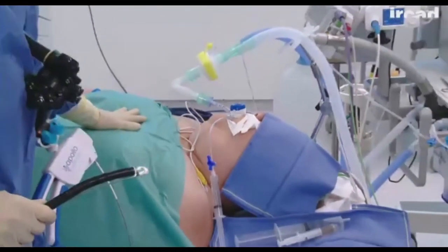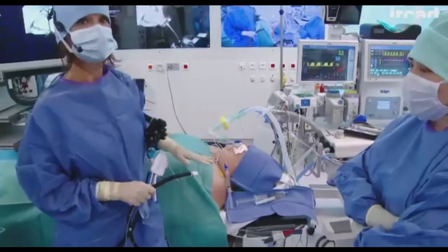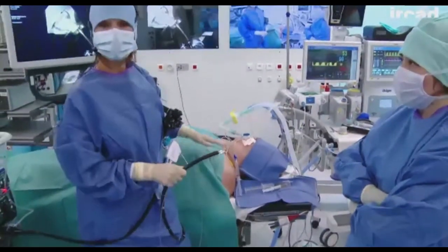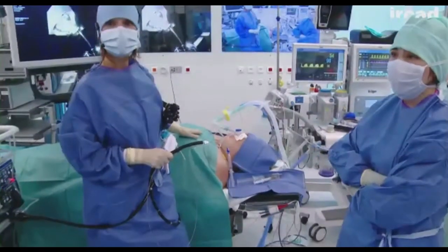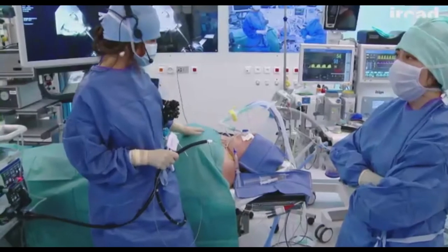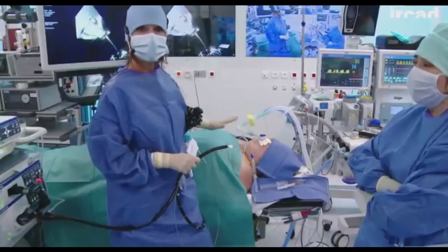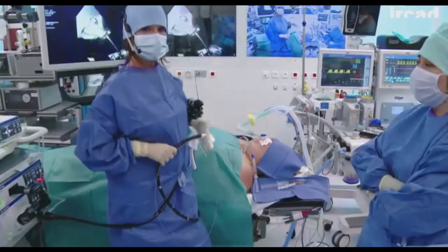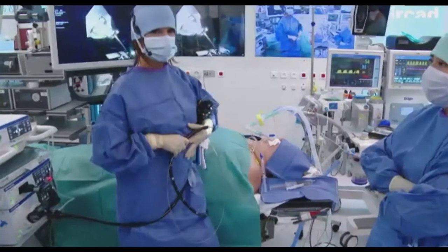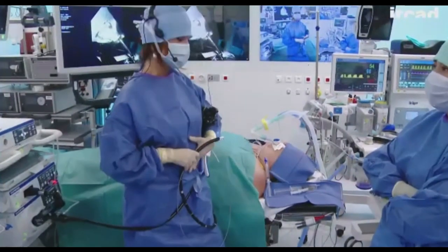I like the patient to be supine because we're working on obese patients. I'd like to have the liver, the bowel, and the omentum away from my working field. We're going to put full thickness sutures, and it's very important to know the anatomy very well. With the patient supine, I can also tilt the patient head up a little bit to facilitate the exposure, because I'm going to move the bowel and the fat away from my working field.